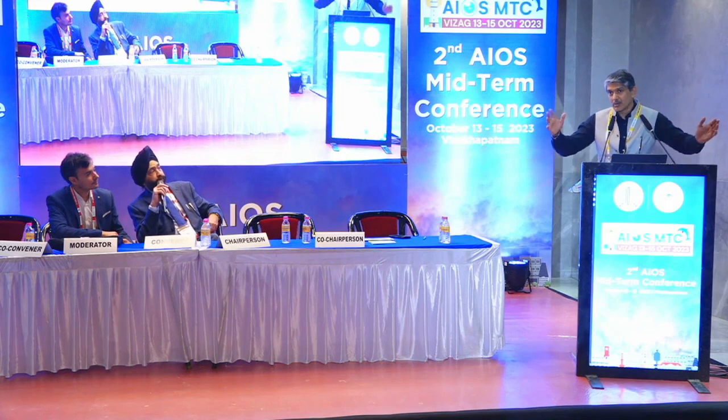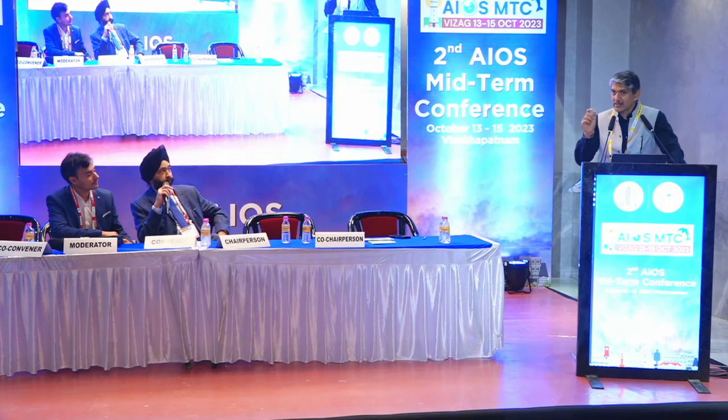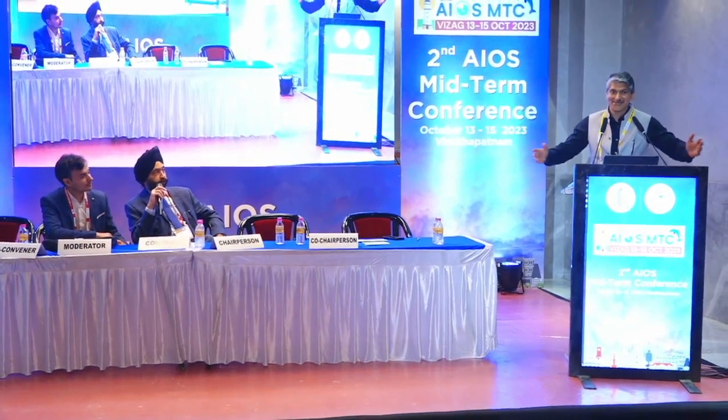If you look at the overall globalization, you may think it's not that much difference, but if you look at one individual patient who has a 12-degree rotation and a high cylinder, like 3 cylinder, that patient is going to be very unhappy. When you look at the whole statistics, thousands of eyes and then 8% with significant cyclotorsion, it may not make that much of difference. But for that individual patient, yes, it will make a difference.